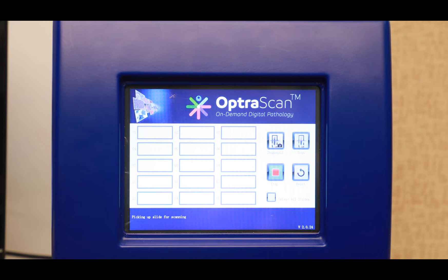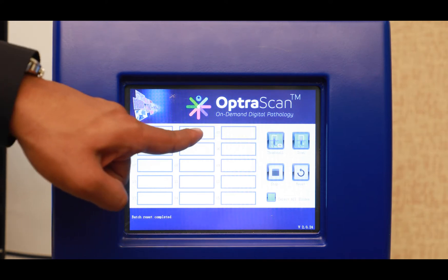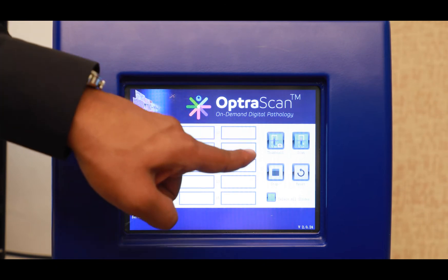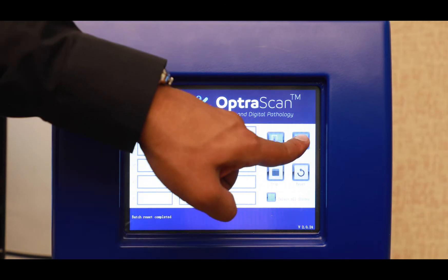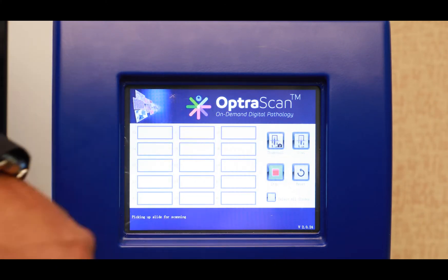OptraScan scanners are equipped with walk-away automation technology. This is achieved by using the provided touchscreen panel to send the scan command, after which the machine takes care of the rest and provides you with the digital image of the slide.